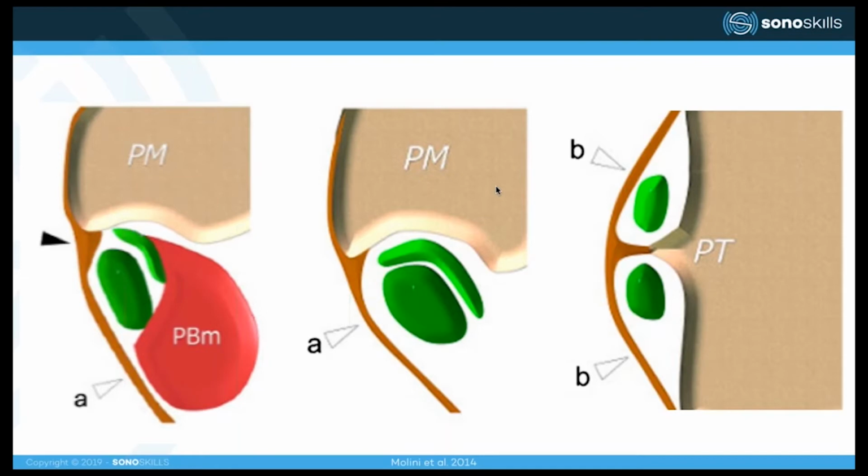So then if you follow the tendon distally, at one certain point you will see the right image, and that's actually the peroneal tubercle, splitting the longus and the brevis tendons in two, right? So they are being separated, and that is quite smart of the body, because the longus at that point goes to the plantar foot, and the brevis continues on the lateral foot towards the base of the fifth metatarsal. So that's also a weak spot.